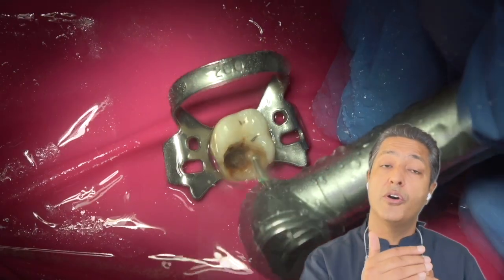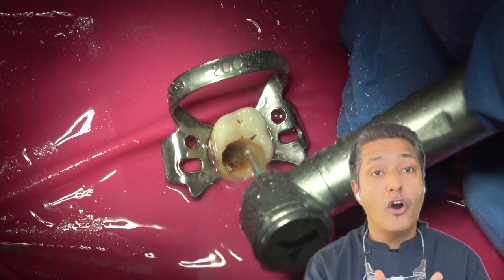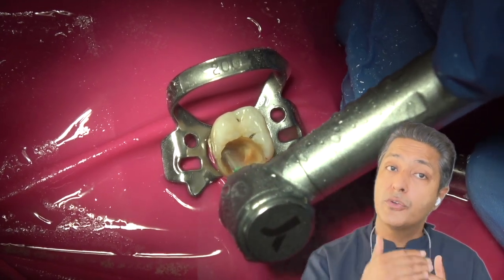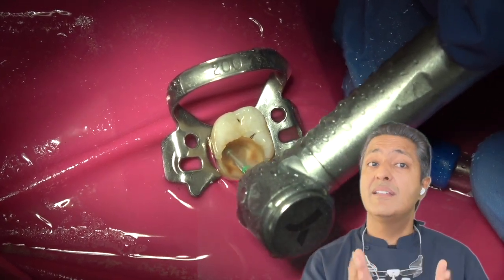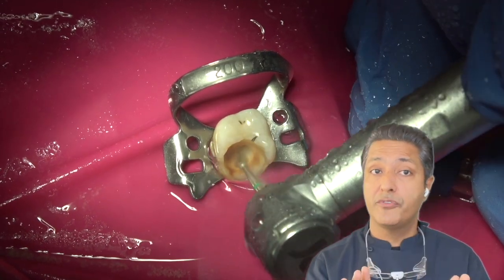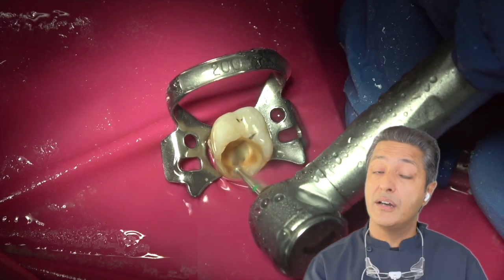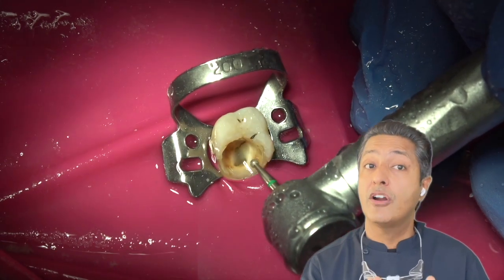Therefore, just keep on brushing the carious lesion until you feel a drop or we enter the pulp chamber. What basically happens is when we are brushing, we are removing the tooth surface and slowly and steadily we are de-roofing the pulp chamber. Once the de-roofing happens and we feel we have entered the pulp chamber, stop at that point of time. We are not in a hurry to complete the access cavity at this point of time, or even to locate all the canals, because probably our access cavity is not complete at this point of time.